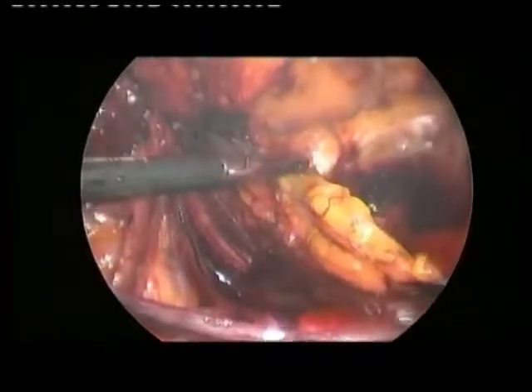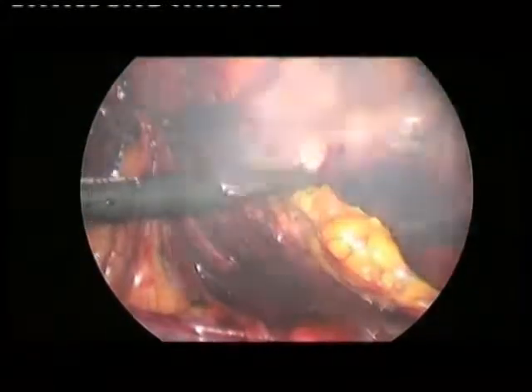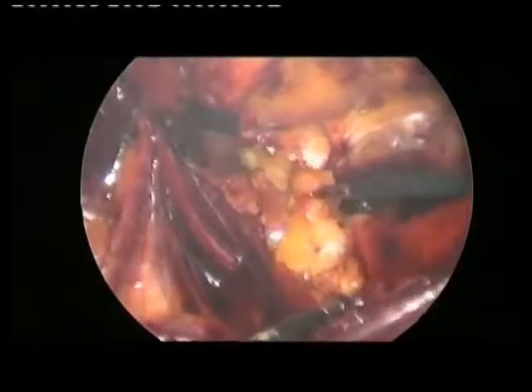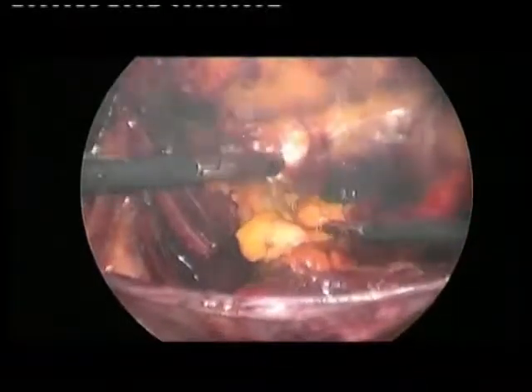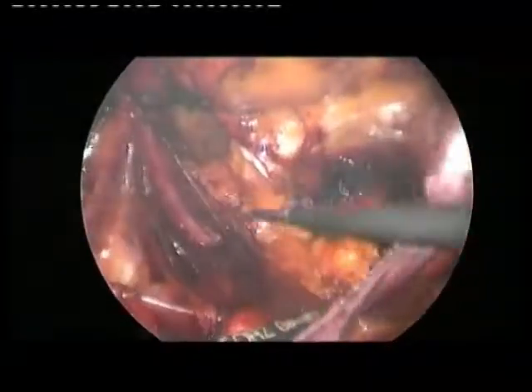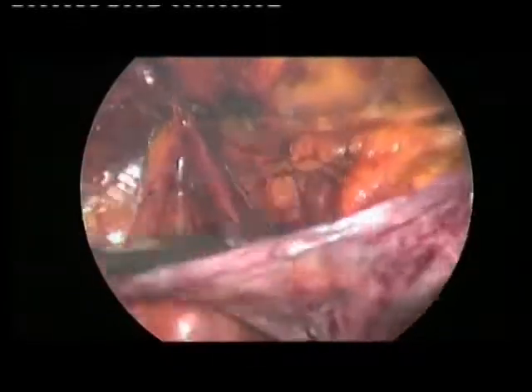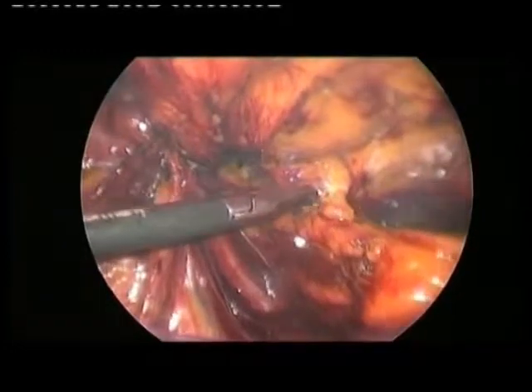This is a good surprise, especially for this conference. Because you understand why laparoscopic hernia repair can be considered superior in some aspects to the open repair. Laparoscopic repair, yes.